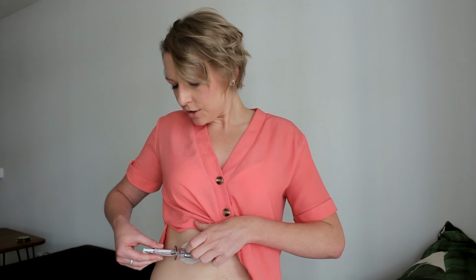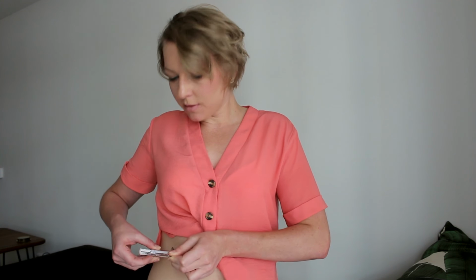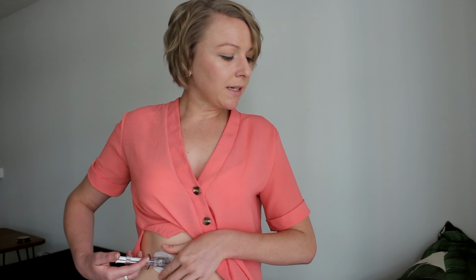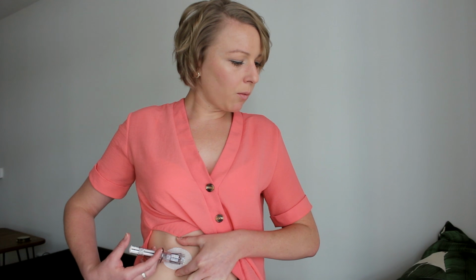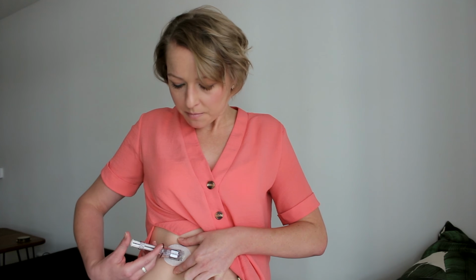The next step is to remove the safety lock. It says just to pull it out, so come on. There we go. Place the fingers of one hand at the edge of the white adhesive. You may pinch up your skin using this hand. Place 2 fingers above the collar and your thumb on the white plunger. Push down the plunger. You should hear 2 clicks. Here we go.